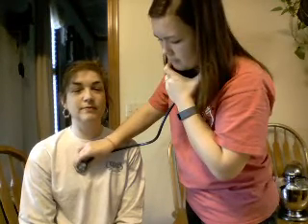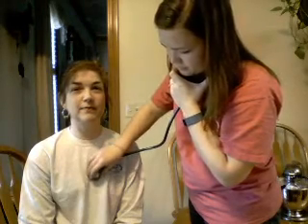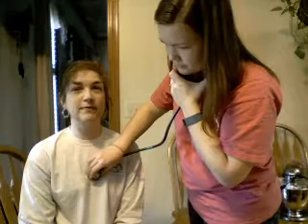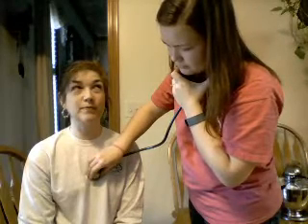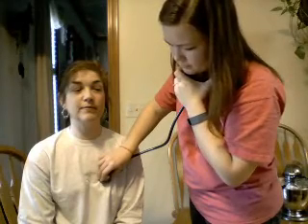So I'm going to be starting on the right second intercostal space. And then I'll be listening for a full minute.